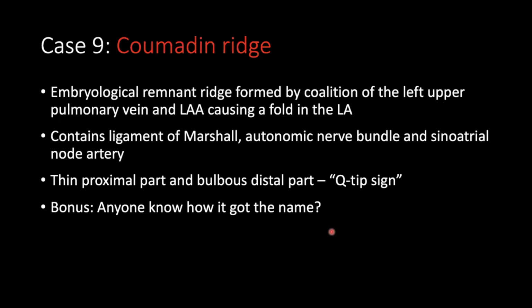Yeah, I heard sometimes there were times where patients would be taken to surgery just because it was so prominent, it looked like a tumor. Yeah, I never saw that, but I heard about that. What your surgical story made me think of is in the very early days with a mechanical mitral, there were situations where the left atrium was full of reverberation artifact, and they actually sent some of these patients to surgery because they thought the LA was full of clot. Before we understood what reverberation was.